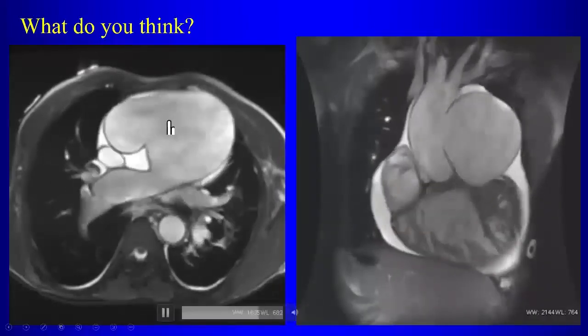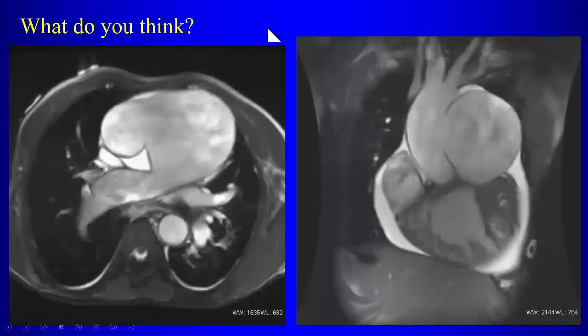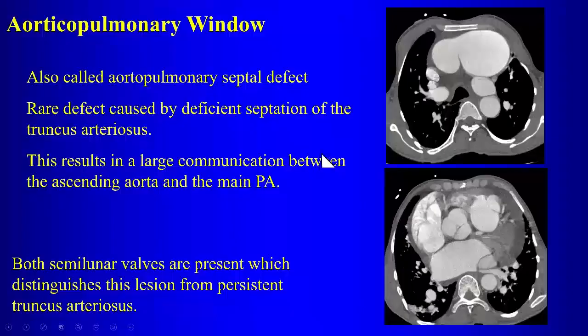So what is this called? There's a term for this. Yes, this is called an aorticopulmonary window, right? So that's an aortopulmonary window, aorticopulmonary window, okay?